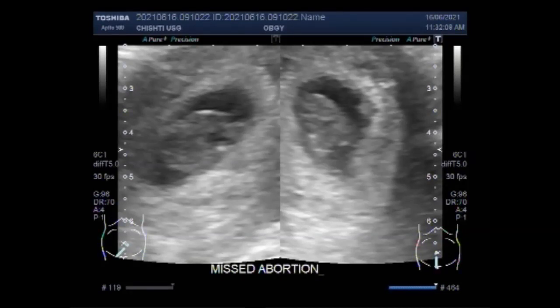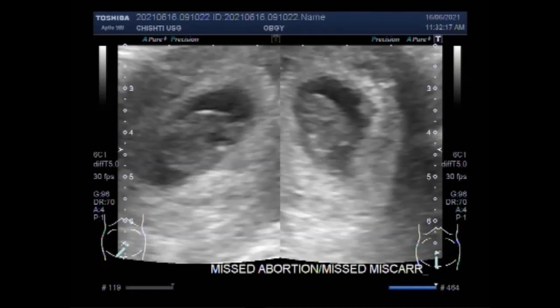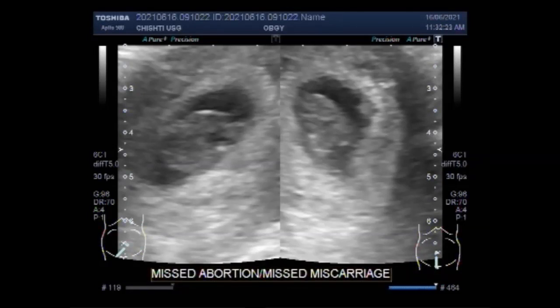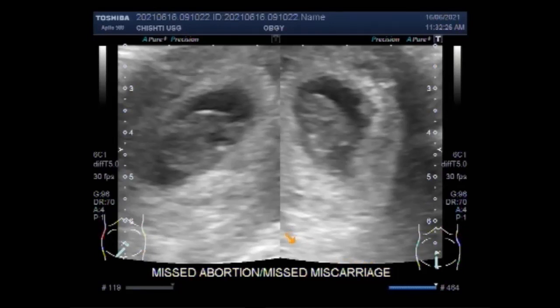To make the diagnosis with ultrasound, the findings may include but are not limited to: absence of fetal pole, lack of growth of fetal pole, fetal pole with no evident cardiac activity, lack of yolk sac at the appropriate gestational age, D-shaped yolk sac, or placental separation.